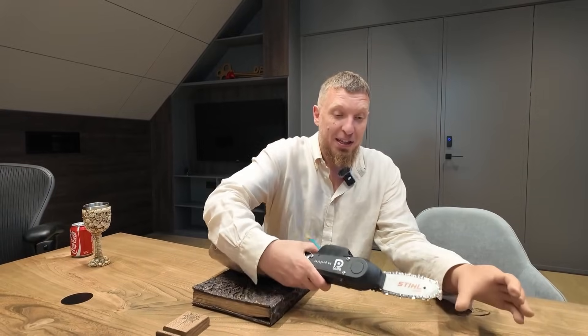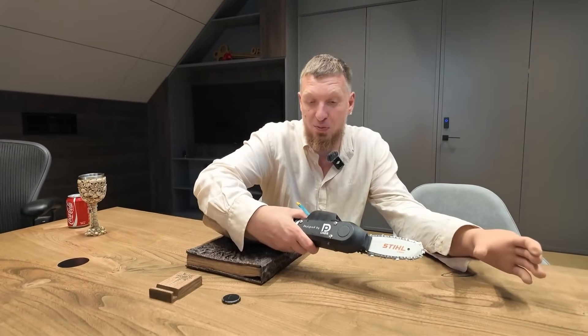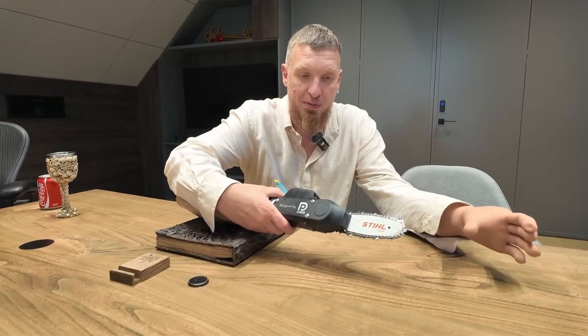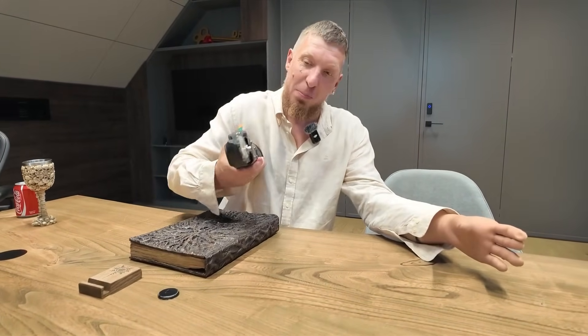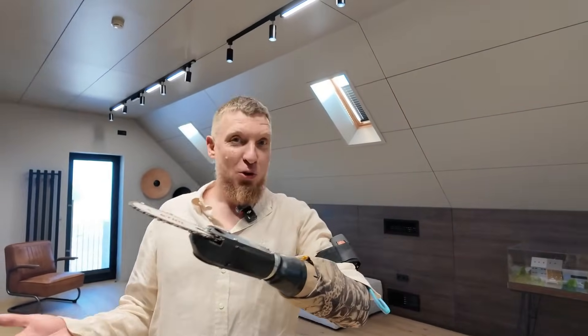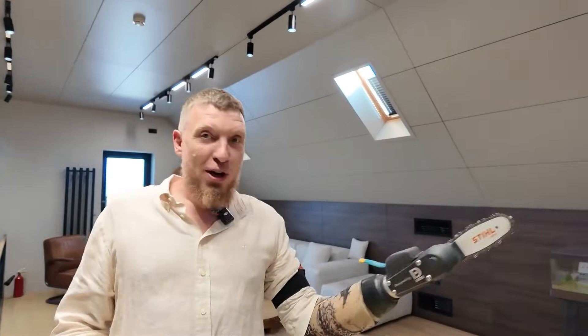The prosthesis' battery wouldn't have been enough so we had to connect its original external battery — so this is in my socket. Now let's take a look and test it out. I've only tested it a little myself, haven't tried cutting anything yet. Let's try cutting something now. Of course it's a bit dangerous, but it seems they've set the sensitivity lower. Let's get started — let's go for the strip.